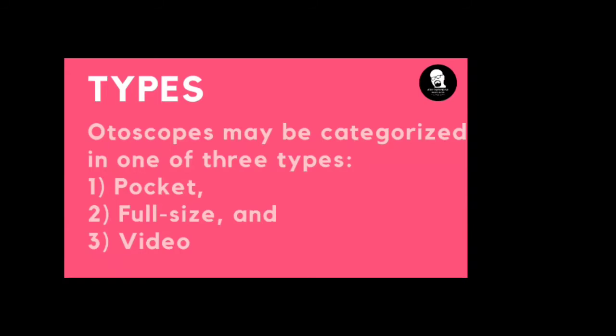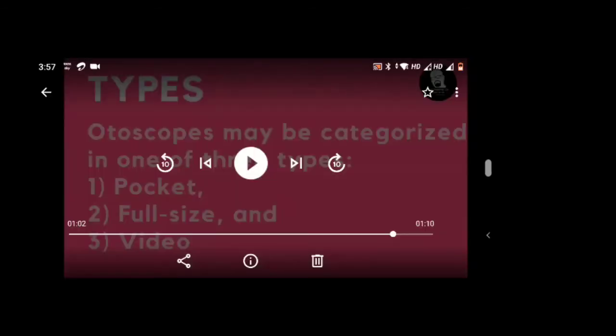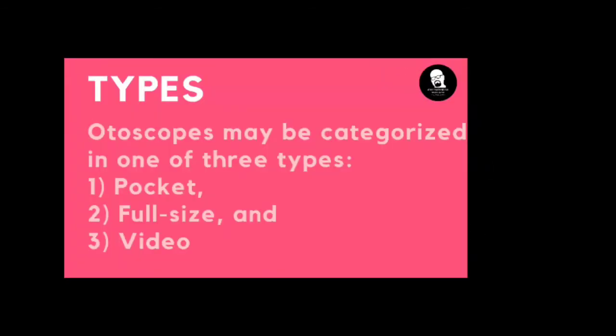And now it's time to say thank you for this particular equipment. I'm going straight to the demonstration, and you can clearly understand how to use it, what parts are available and the purpose of each and every part. I will explain all these things very clearly. Go and see the particular thing.